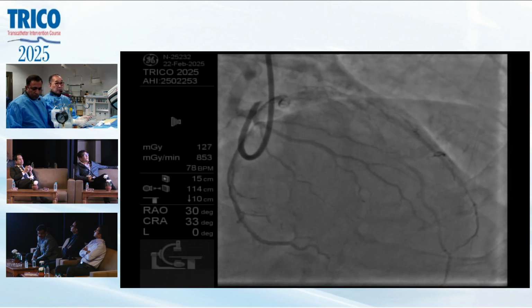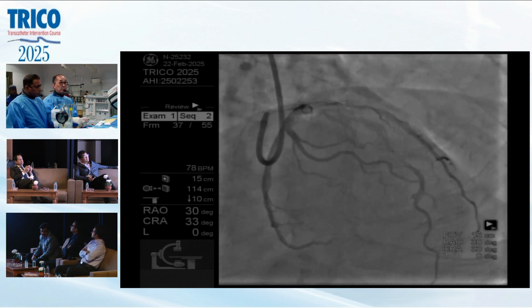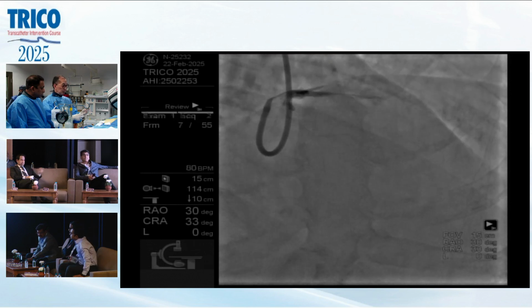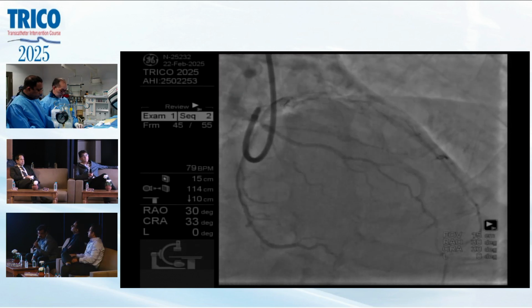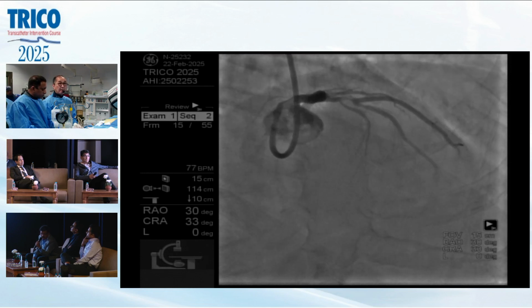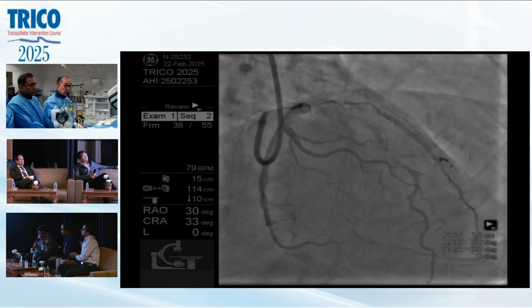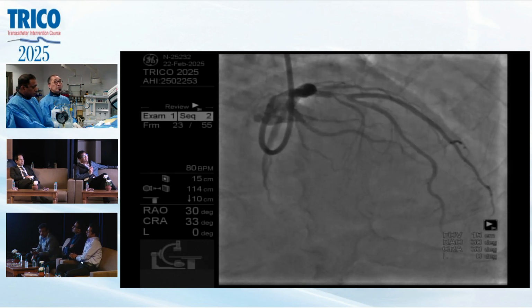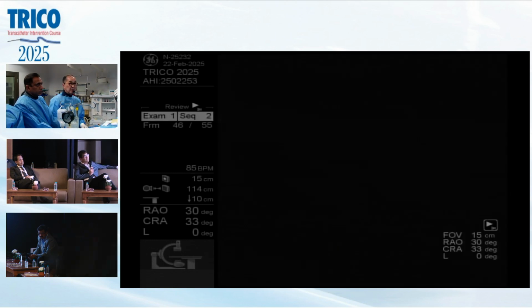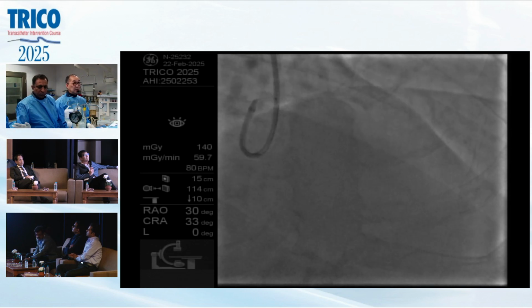Okay, now you see the two angiograms. One's an RAO view, one's an LAO view. What do you think, panel? I mean, it's a true bifurcation case. 0, 1, 1, 0 in the RAO cranial. 111 lesion. Good, true bifurcation. Actually, the LAO view shows 111. We can show you the LAO view a little bit.